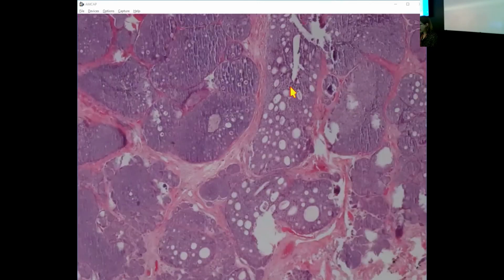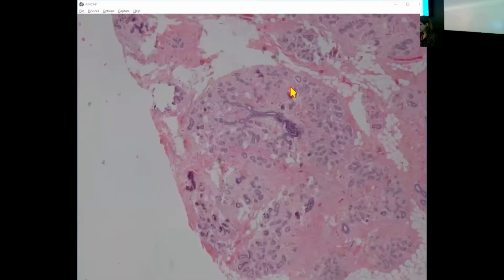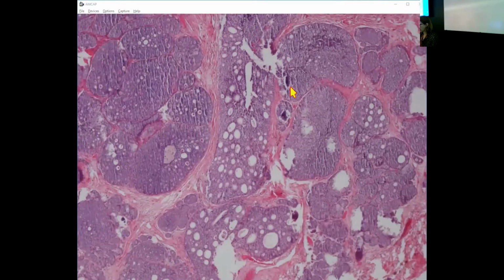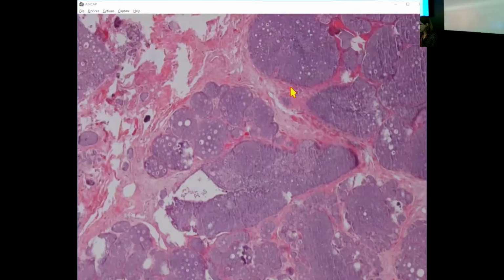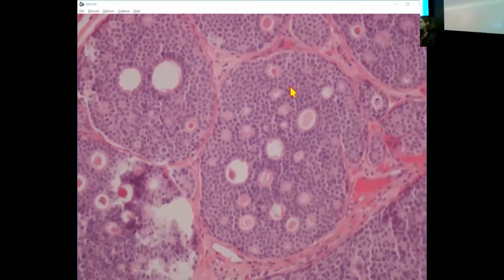So now we've got a much more extensive area, right? It's still, oh no, this is an excision now. So we've got a much more extensive area of involvement. And so no question that we're dealing with carcinoma in situ, right? It's extensively involving many spaces, really nice round cribriform. And this is such, I love polarization. I think it's so neat and tidy. I like when you find it and it's doing its thing so beautifully as in this example here.